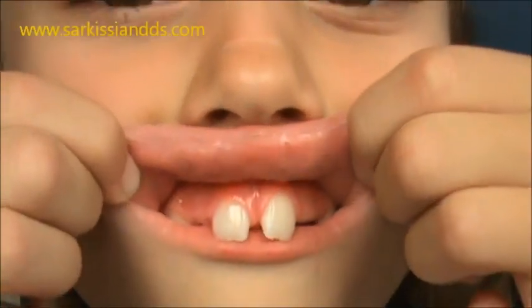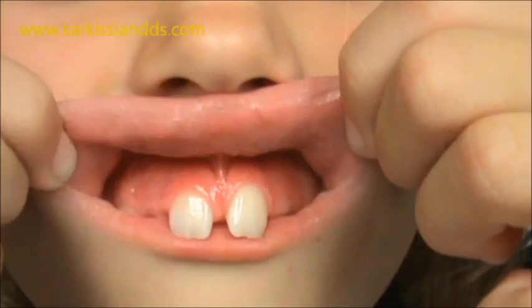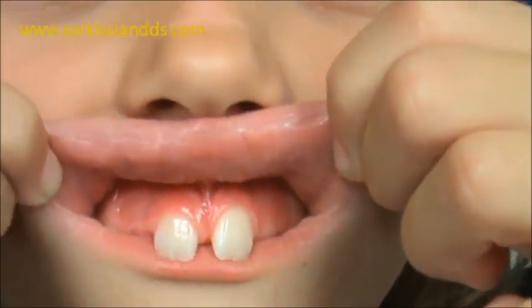What do you think we're doing today? We're going to laser your little band that's on top of your two teeth. You want to show me? Pull your lips up. That's a very tight band and we're gonna laser it, okay? I'm gonna numb you a little bit, and then the laser will just take five minutes and you won't feel anything.